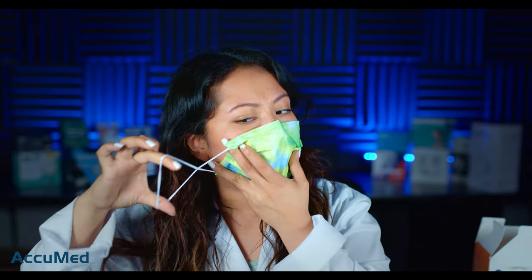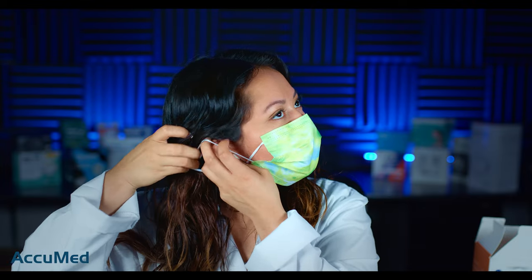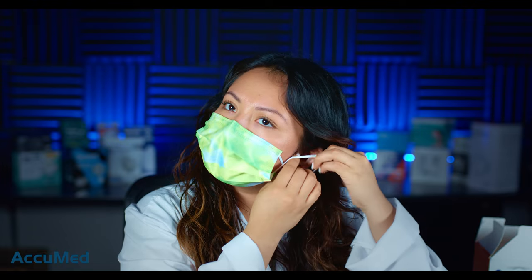A lot of people do this sort of hack where you make the mask tighter like this. Let's go ahead and try that — but even like this I feel like I'm still getting a lot of leakage. This hack doesn't really work for me.